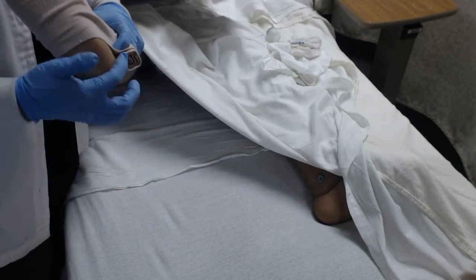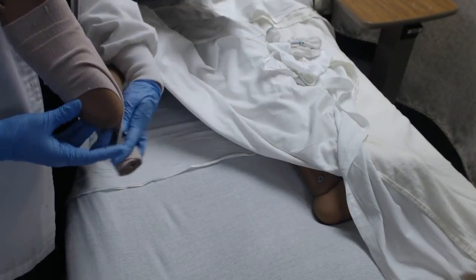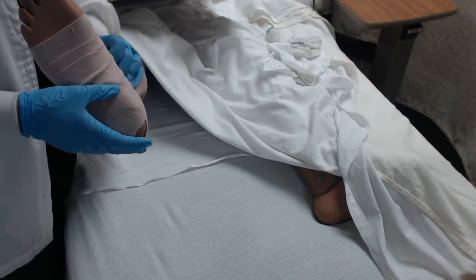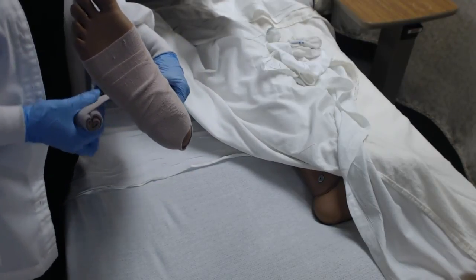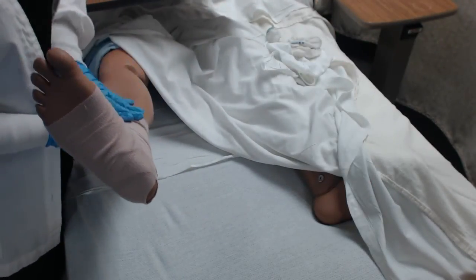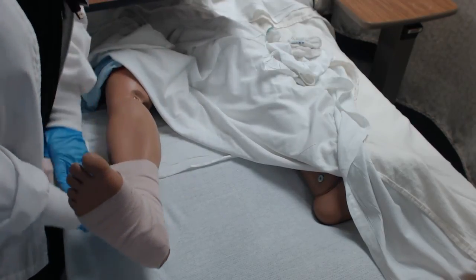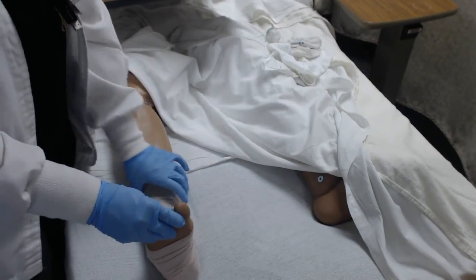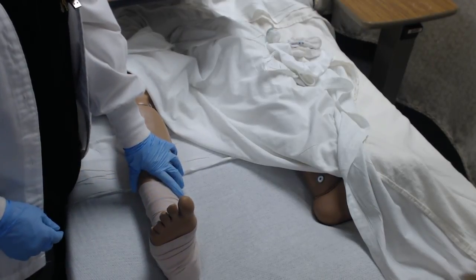Generally speaking, I leave out the heel. I think this is a good opportunity for me to assess the heel. But if the patient really has a lot of edema, then you can certainly go over the heel. And then you would continue wrapping up the leg, again overlapping at about an inch to a half an inch. Just like with the TED stockings, we're also going to make sure that we assess CMS and our capillary refill before we apply this.